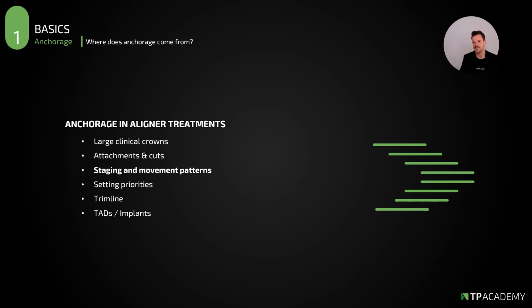So as we know, we have the Invisalign software. This is what we have done for 20 years. We have the Spark software. The staging is a little bit different. We have the Angel Aligner software, and it's very interesting. We even got new tips and tricks of doing staging sometimes differently, for example, if we do space closure, something like that.